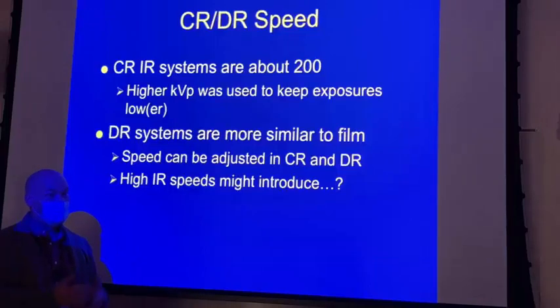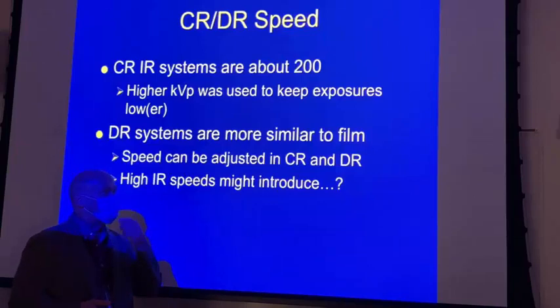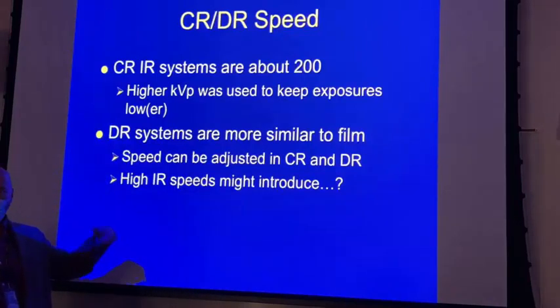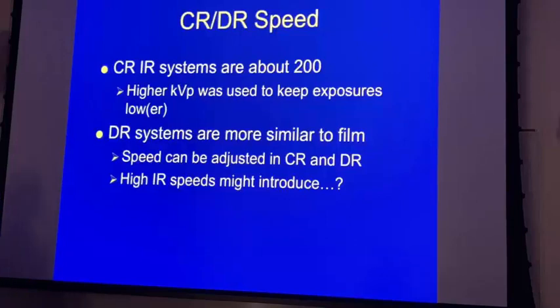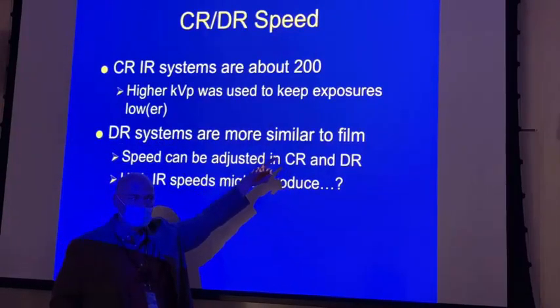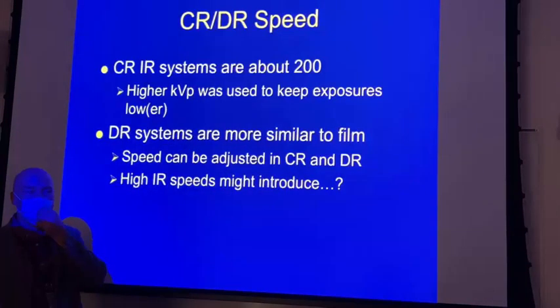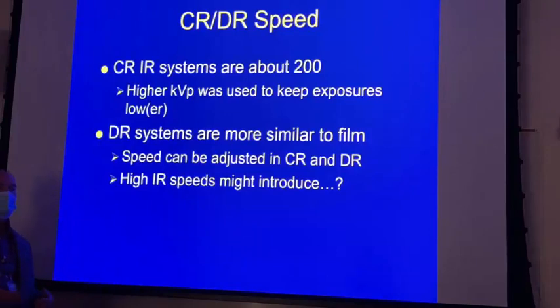Increase? Okay, increase, but by how much? Double kVp? 15%. Yeah, that'd be double mAs, 15%, right. So what we did was whenever we went to CR, we increased kVp by 15%. Okay? So now we reintroduced that exposure that we lost. We didn't really lose exposure, we lost detection, essentially, right? So by increasing kVp, that went away.